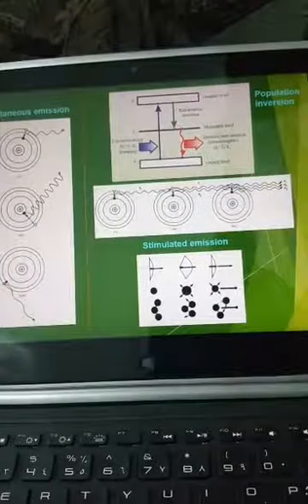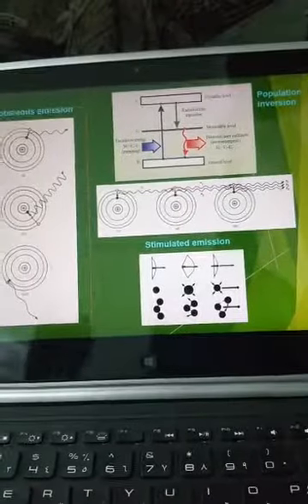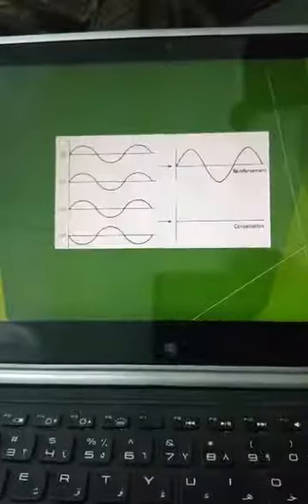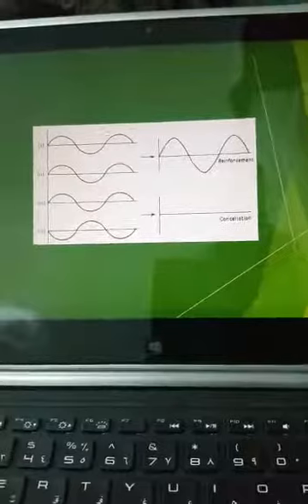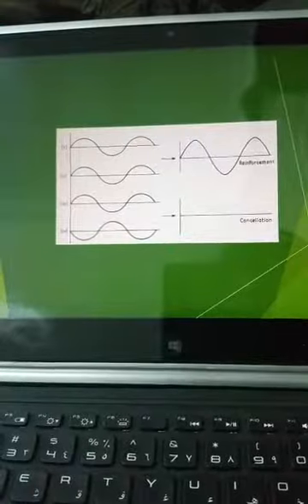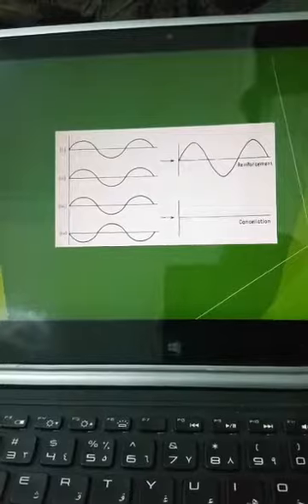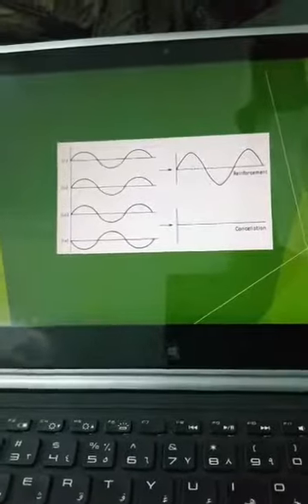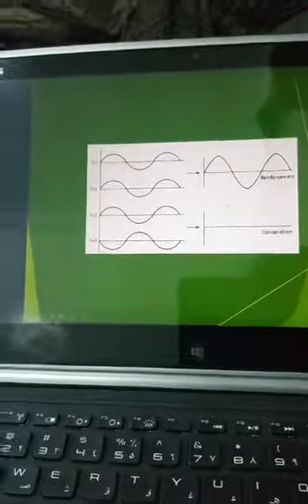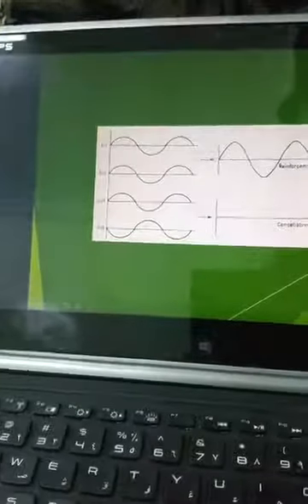Although it is visible like KTP or argon and the visible light or ruby, but it is more intense. So the reaction with the tissue is different than normal light. This is, if you remember, we've studied this before, two wavelengths coming together. From here we measure the wavelength, but the height here can be increased or reinforced if 2 or 3 or 5 wavelengths come in harmony together. And this we also study in physics: if they are in opposite positions, they are going to cancel each other.